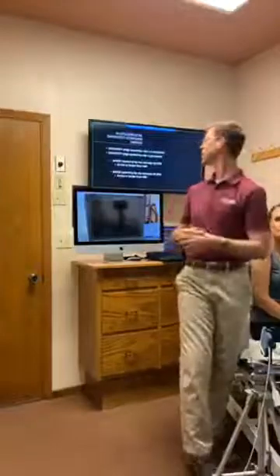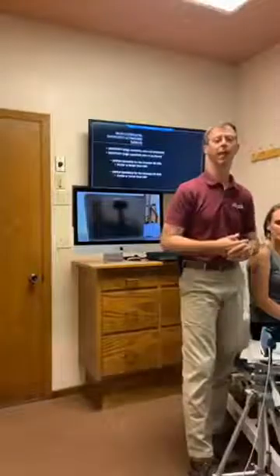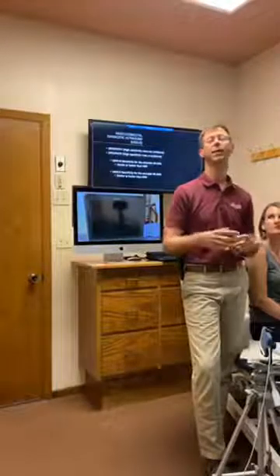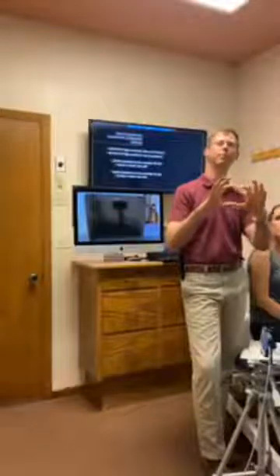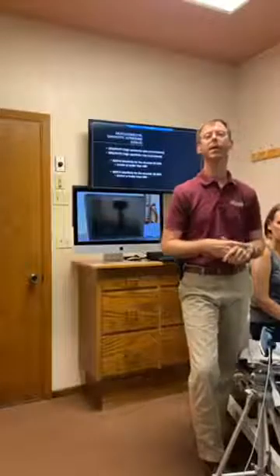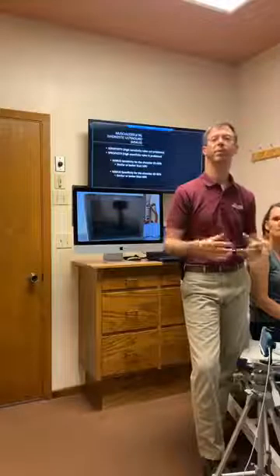So musculoskeletal ultrasound has a specificity and sensitivity of 85 to 90%, which is equal or better than an MRI. Now, it does not show everything that an MRI shows, in that it does not show fibrocartilage. So at the shoulder, you will see the outline of the labrum. The labrum is a fibrocartilage ring on the shoulder blade, which deepens the socket. You will see a little piece of it, but it cannot look at the entire structure, so it's not diagnostic for that particular structure. But for tendons, muscles, ligaments, bursa, and many other structures, you'll see joints, you'll see arthritis.